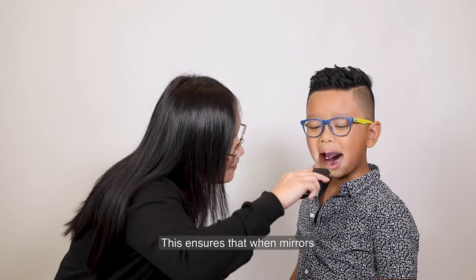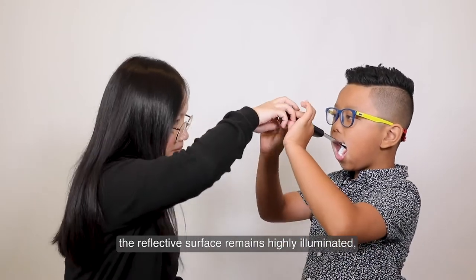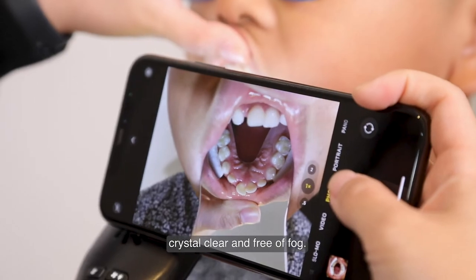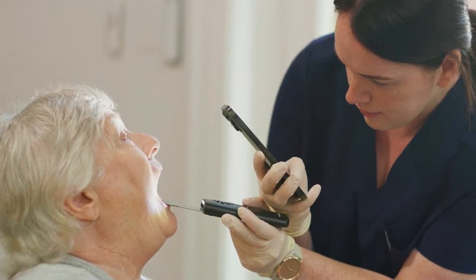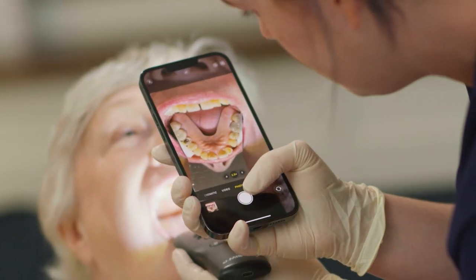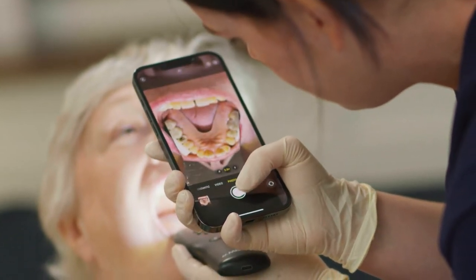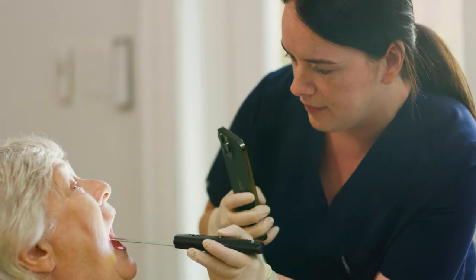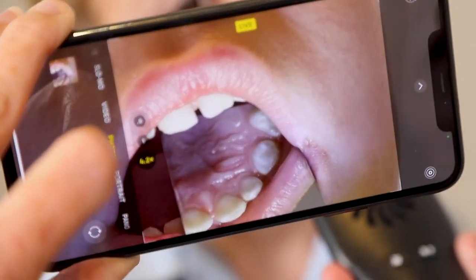This ensures that when mirrors are attached to the device, the reflective surface remains highly illuminated, crystal clear and free of fog. Used in tandem with the new generation cameras in the latest smartphones, high-definition images are quick and easy to capture with minimal training for your staff. The Demystify Kit is invaluable in every realm of dental practice.